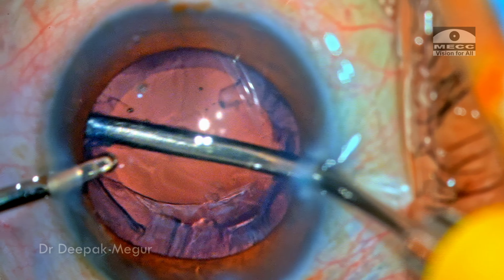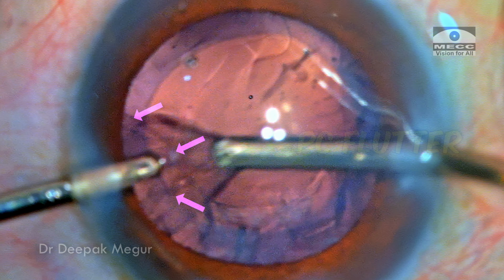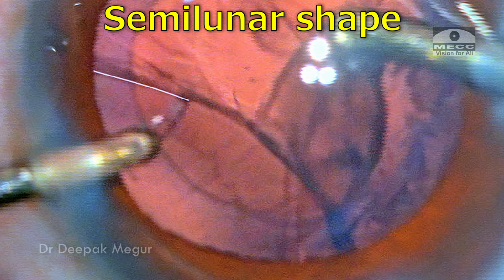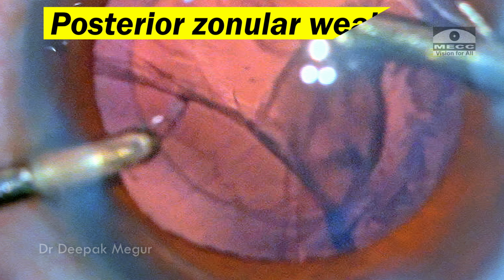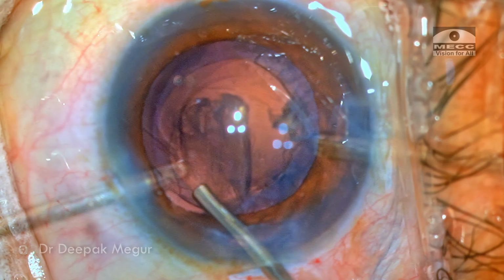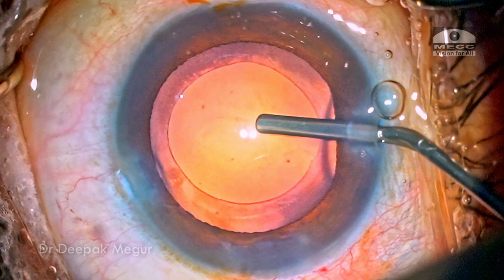The cortex is quite sticky to the posterior capsule, and when trying to aspirate, we can see that in slow motion the posterior capsule is fluttering, and in this quadrant we can see the semilunar shaped sign, and for a novice surgeon it could mimic a posterior capsule tear. But in this case there's no posterior capsule tear, it's just a localized area of posterior zonular weakness. And the management again is going to be just fill in the bag and thread in a CTR to support that area, and the bag will be fine.